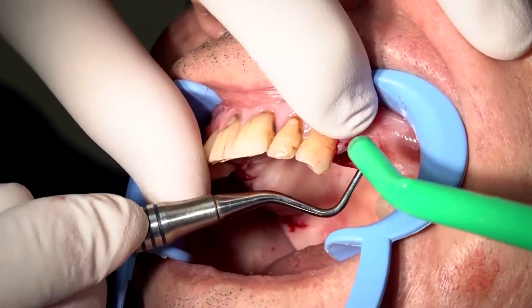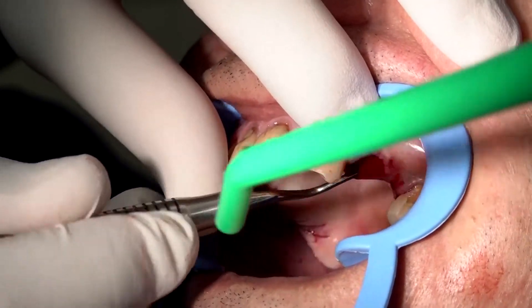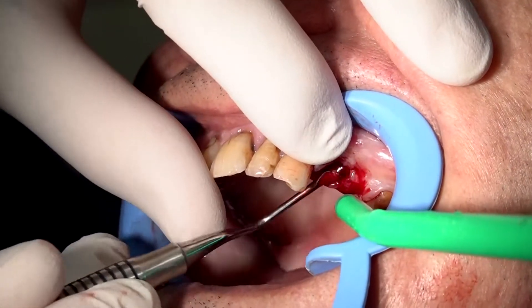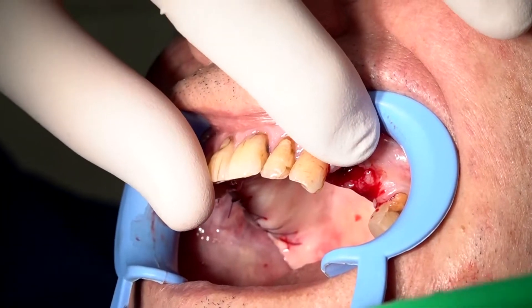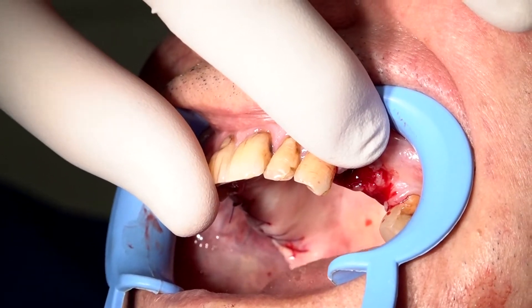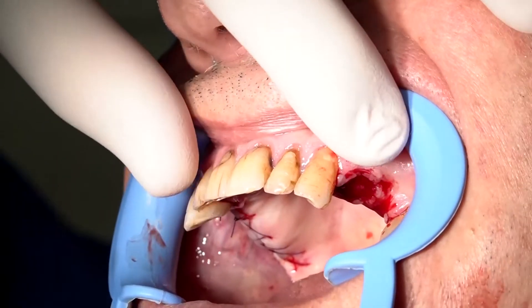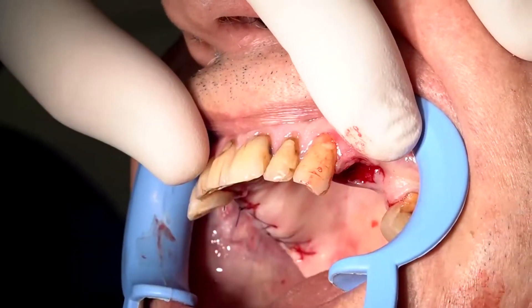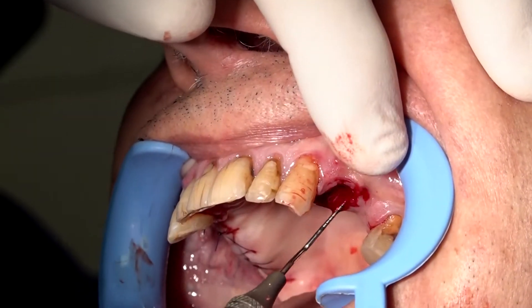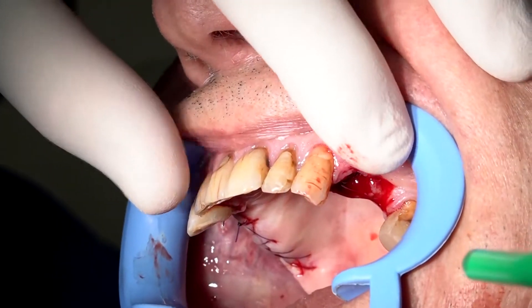It is very important to clean the socket and to remove all of the granulation tissue. We check and we can see as well that there is no buccal plate here.